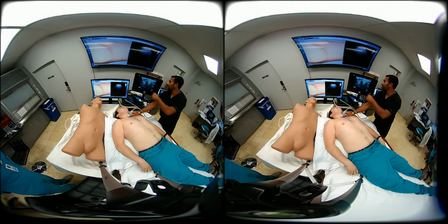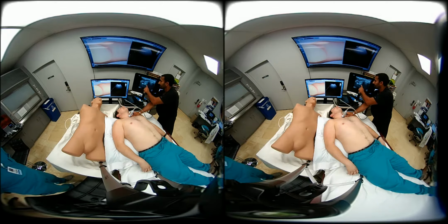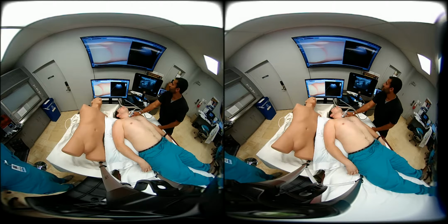We see the hyperechoic reflection of the cartilaginous rings of the anterior aspect of the trachea, and then we're going to scan. The indicator here is the patient's left side, and we're going to look for structures that potentially could be the esophagus. And this is the esophagus right here, just lateral to the trachea. So the transverse position is great to identify the location of the trachea.